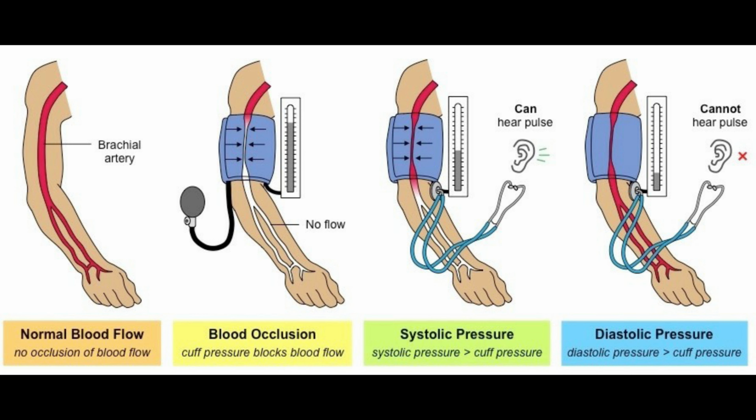I'm sure everyone has noticed this NIBP cuff, designed to encircle the upper arm. Inside that, you can see a flat rubber bladder connected to an air supplying tube.